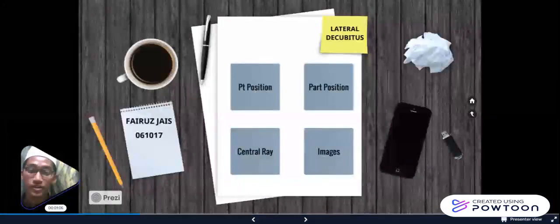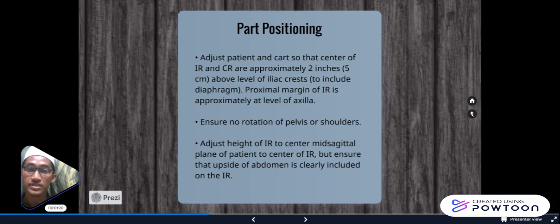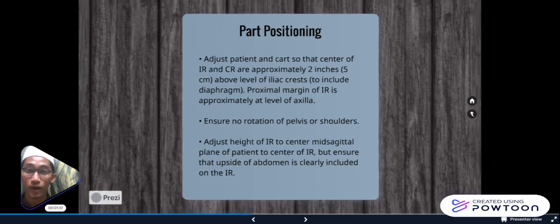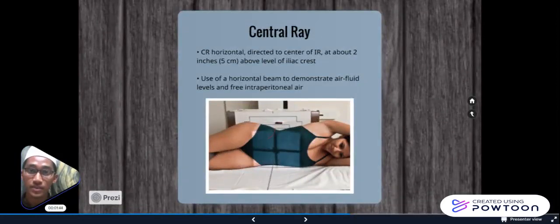For the part positioning, we should centre the image receptor to the centre ray at approximately 2 inches above the iliac crest, and the proximal margin of the image receptor should be at the level of the axilla. We should ensure there is no rotation of the pelvis or shoulders and adjust the height of the image receptor, centring it to the mid-sagittal plane of the patient. For the centre ray, we should direct the horizontal beam to the image receptor, approximately 2 inches above the iliac crest, to demonstrate air-fluid levels and free intraperitoneal air.